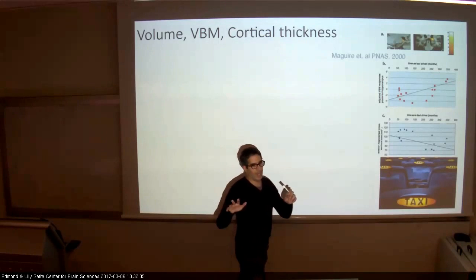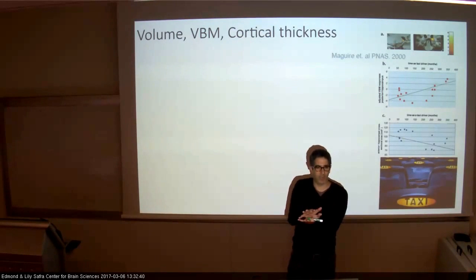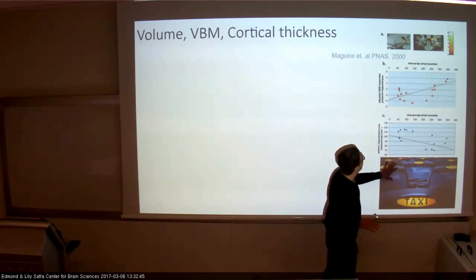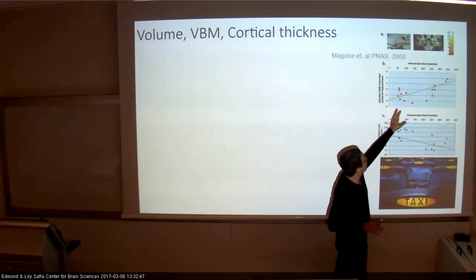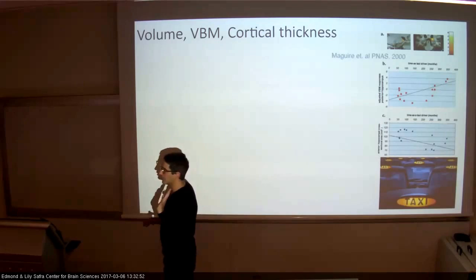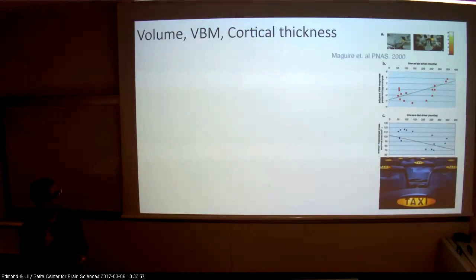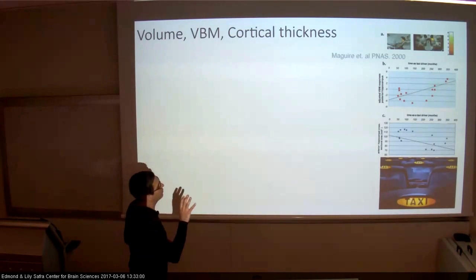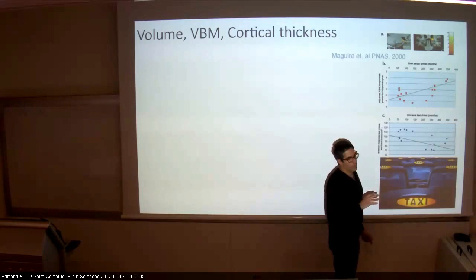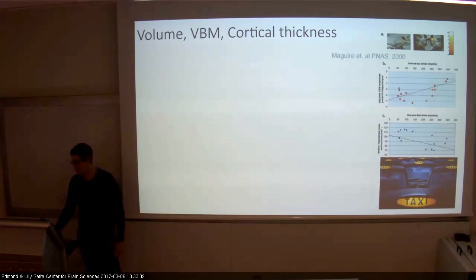And so now we're moving to people somewhere between image processing and statistics. Now, statistics becomes really important. So here they were looking at the hippocampus. I will explain exactly what. I just want to show you the things that are done with this type of method, looking at those images. They found that if they compare normal drivers versus drivers in London before Waze and GPS and so on, so they actually had to know the map.